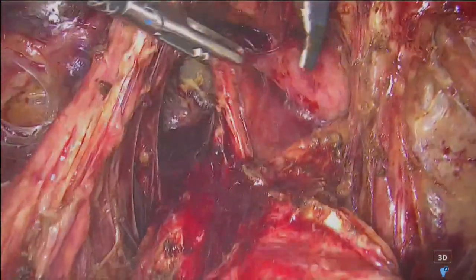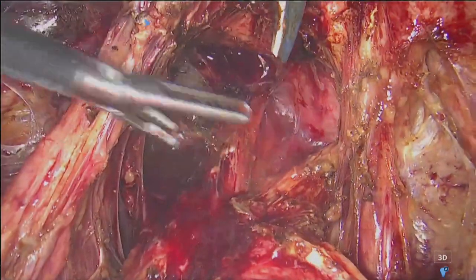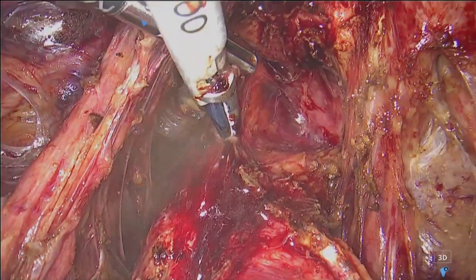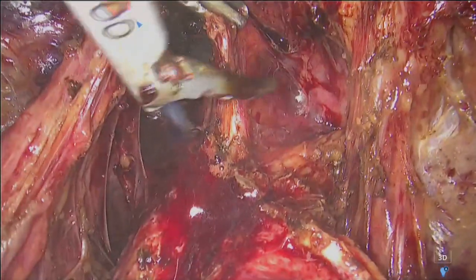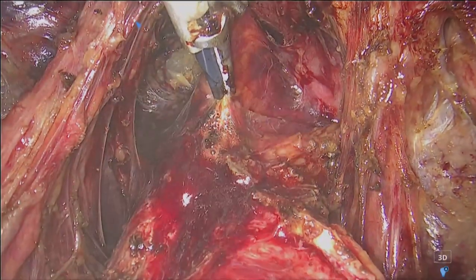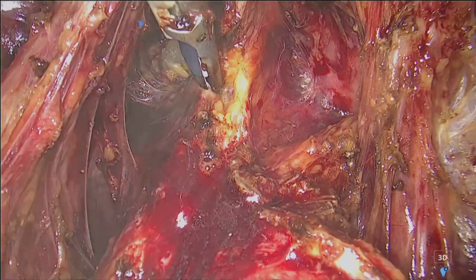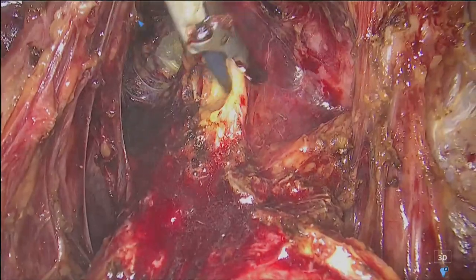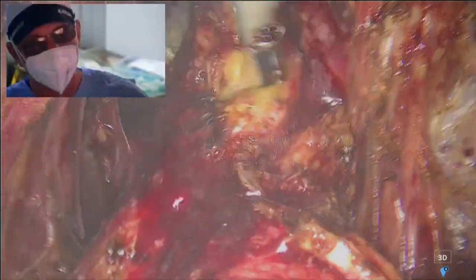You see that this is all the fibrotic tissue around the rectum that we can remove, because this is superficial disease on the serosa of the rectum. We have to remove it with the shaving technique, and then we can resect the rectum more cranially, and we reduce the risk of complications.